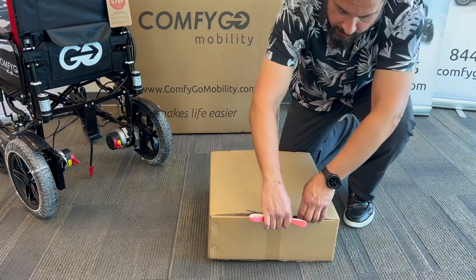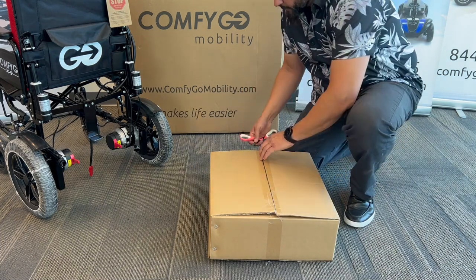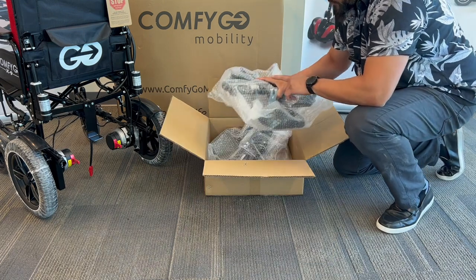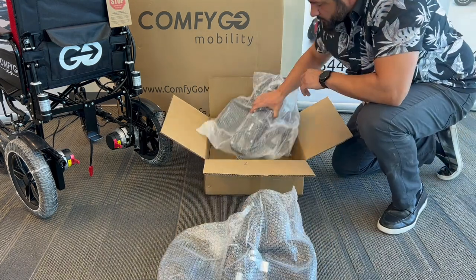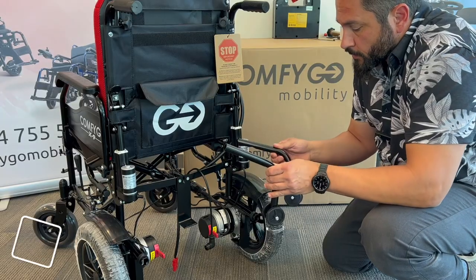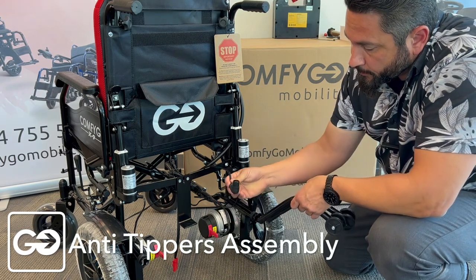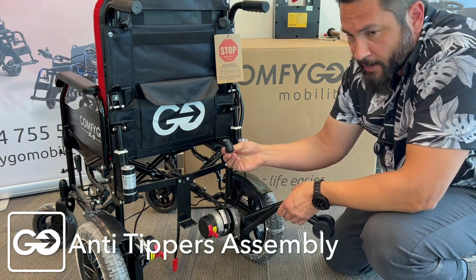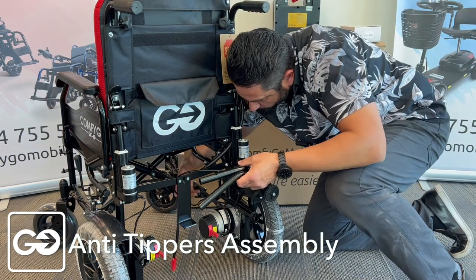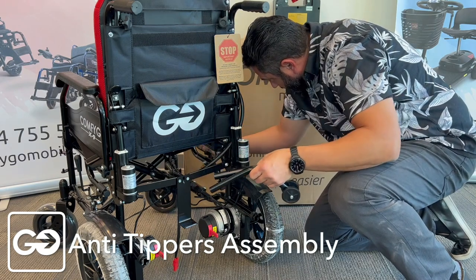We're going to open up this box here — it has some of our accessories in it, including our leg rests and our anti-tippers. In here you're going to have two leg rests with actuators, a left and a right, and you also have your anti-tippers. Before we install the anti-tippers, if you take a look at this cable here, it actually has to move towards the front — pull it through, as this is part of the controller system.